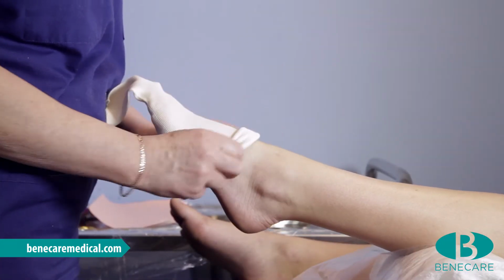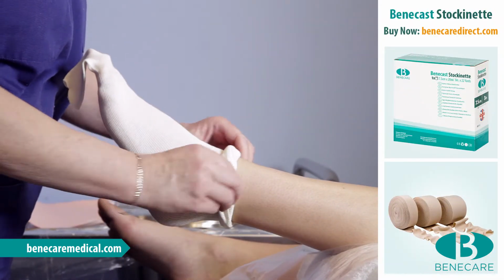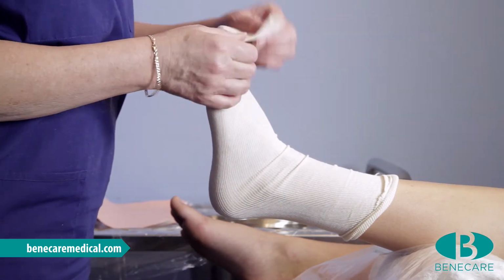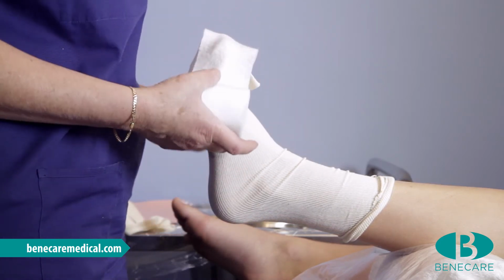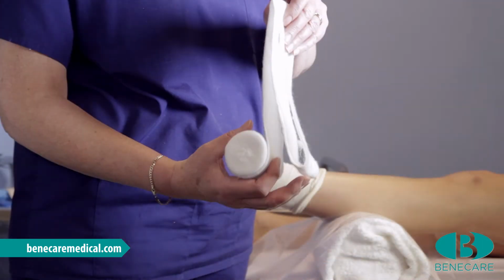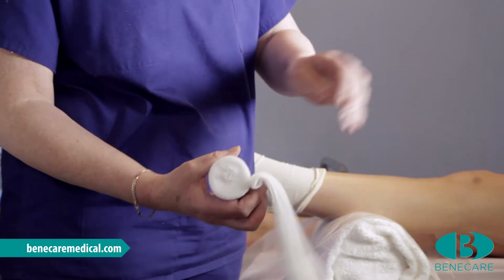Apply 1 layer of Benecast stockinette to the foot. As the foot is a different shape offloaded than when loaded, I'm going to create a void. I will do this by making a slab using Benecast synthetic Undercast padding. The slab will need to be a minimum of 6 layers.